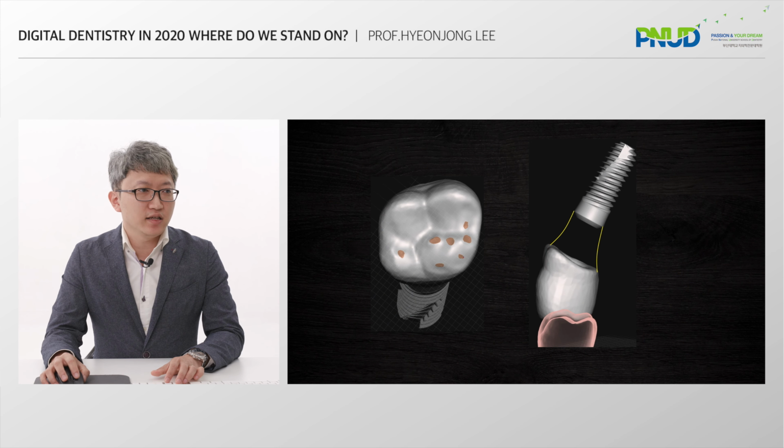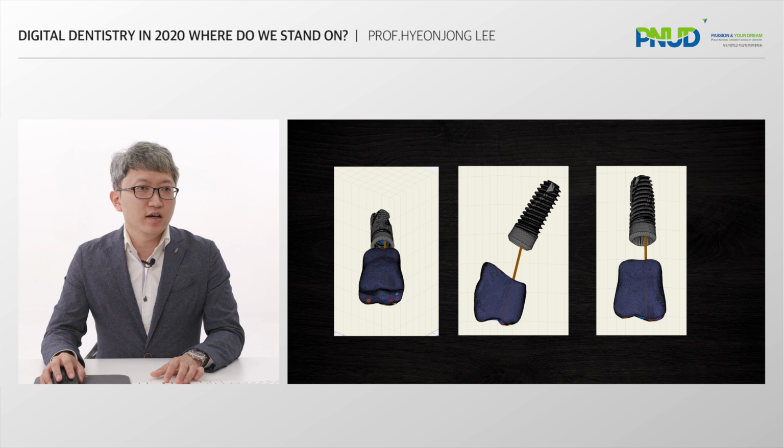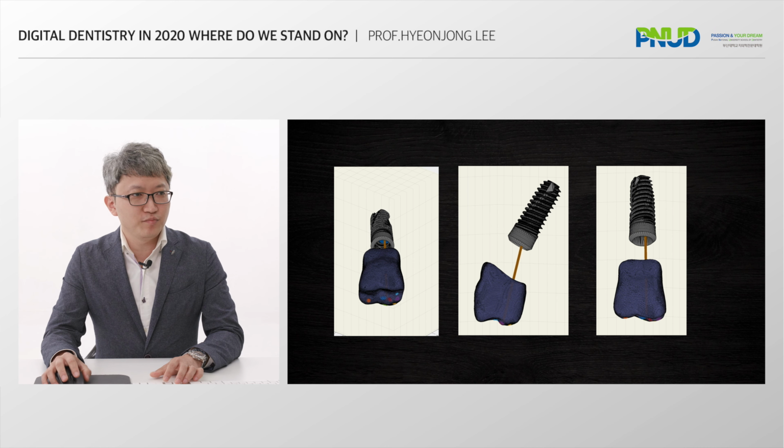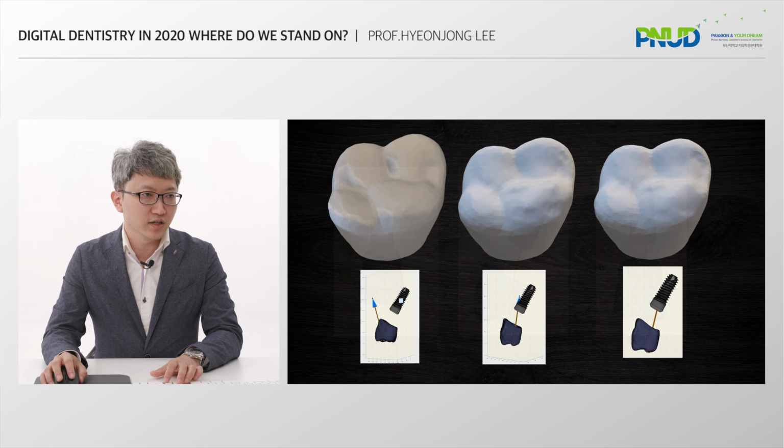And this was the third version of the occlusal design. Now the mean vector is really towards the center of the platform, and there would be much less torque compared to the first version of the occlusal design.